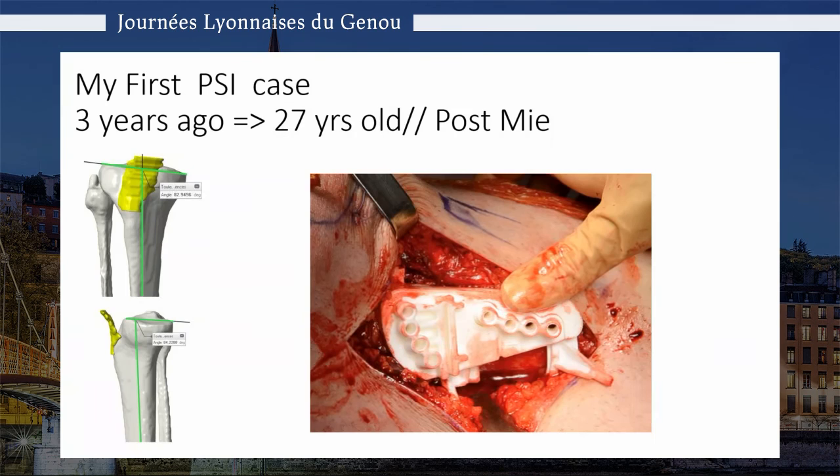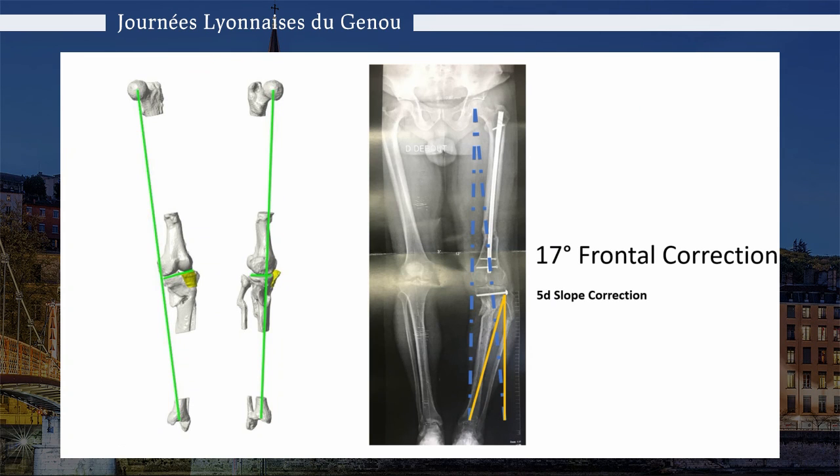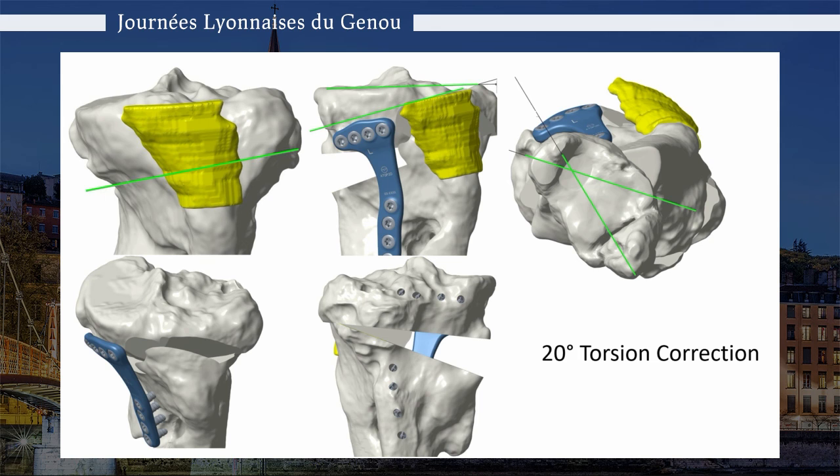I can tell you that since my first use 3 years ago, in 2016, we have been doing more and more complex cases with, for example, this 17-degree correction plus 5 degrees correction plus 20-degree torsion correction in a post-traumatic setting.